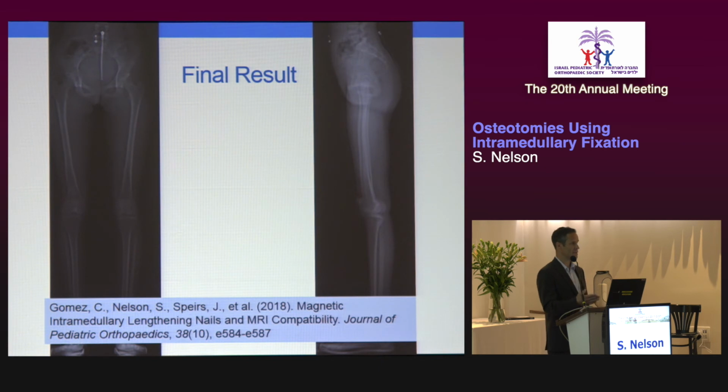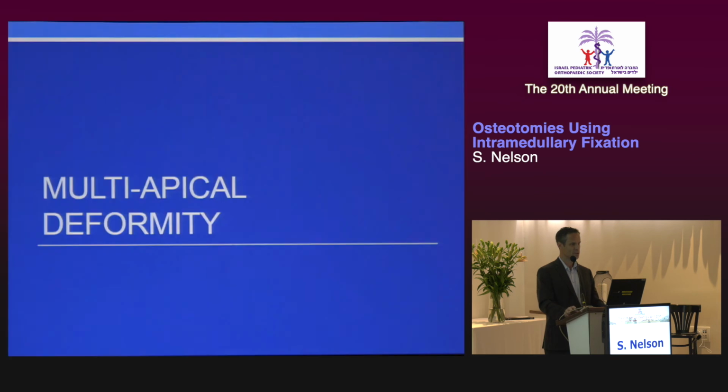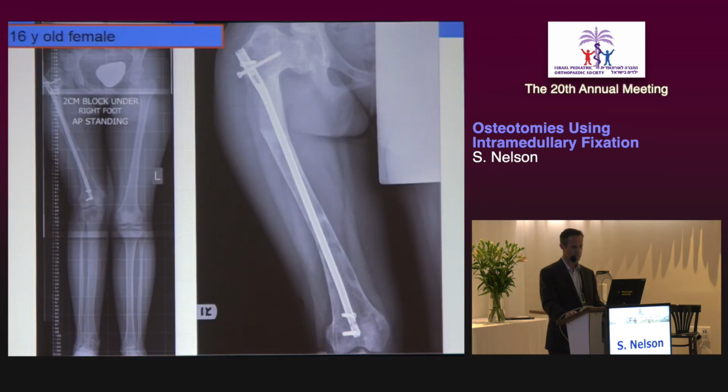It's actually not necessary that you have to remove all of the magnetic nails. We published a report on the function of the Precise nail after having MRI. There are no adverse consequences to doing an MRI in patients that have a Precise nail. No heating, no unintentional distraction or projectiles creating danger in the MRI scanner, but the 3 Tesla MRIs will deactivate the Precise nail, so it can't be reused. It takes away the magnetic mechanism.